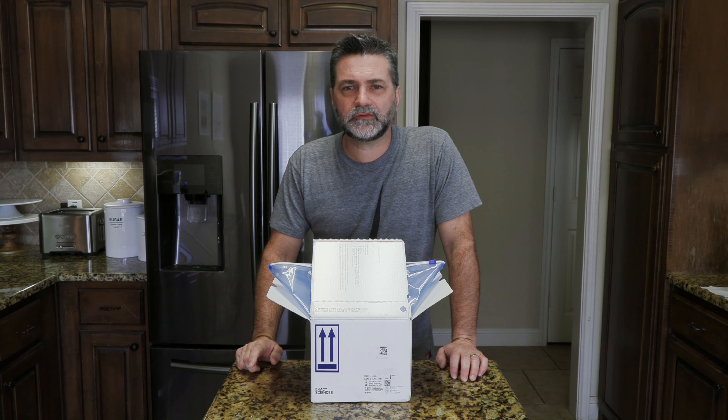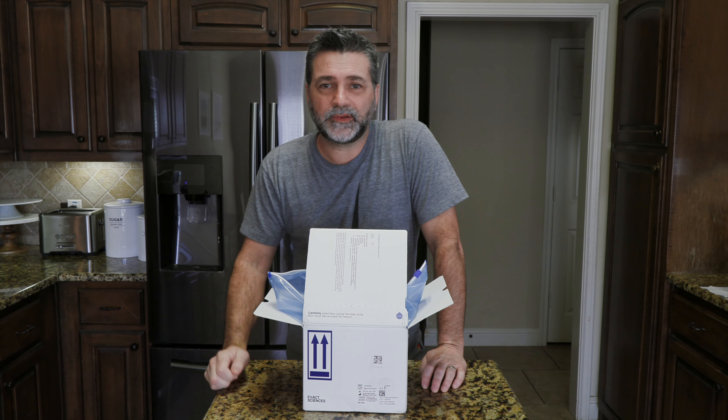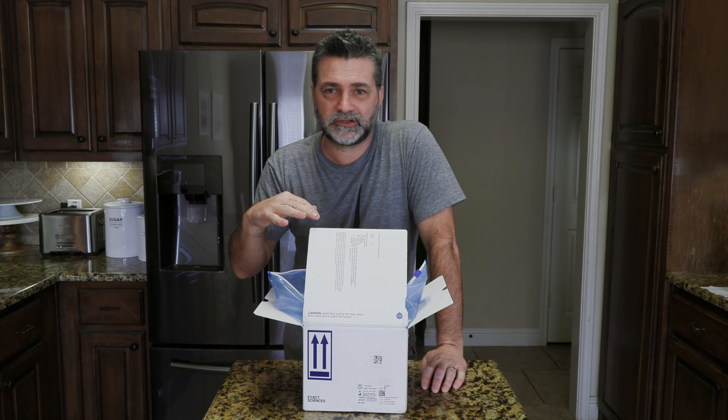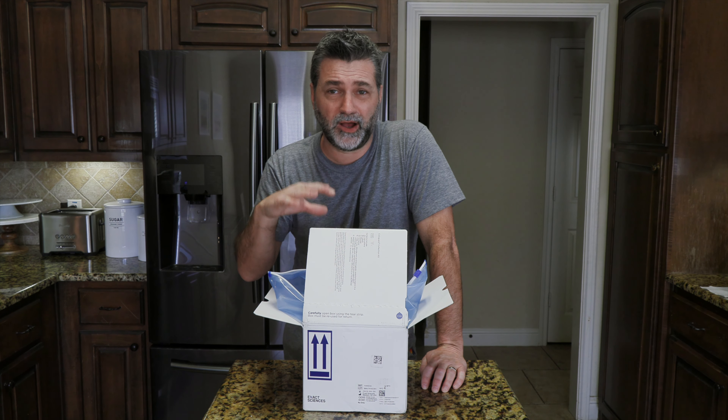So I went to my doctor a few months ago to get my annual checkup, which I haven't been in a few years because of COVID and just haven't gone. But I finally went a few months ago and my doctor asked me, have you gotten a colonoscopy yet? I said no. He goes, do you want me to schedule one for you? Not really. So he gave me another option, which was to do Cologuard, which is what this is — they mail this box to you.